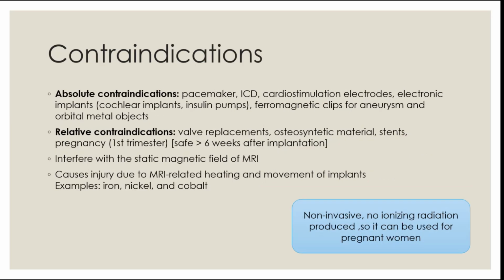Contraindications are any ferromagnetic object. It could be clips that are used for aneurysm, some pacemakers, some stents, because the problem with these is that they will interfere with the magnetic field and can produce artifacts, and it can also harm the patient themselves because it can lead to the risk of heating of the object, and also if it's a pacemaker, it can lead to malignant arrhythmias.